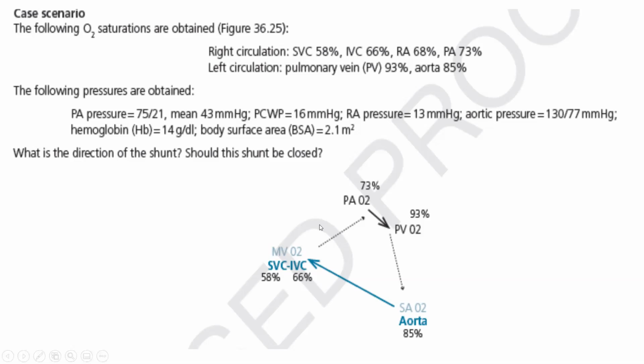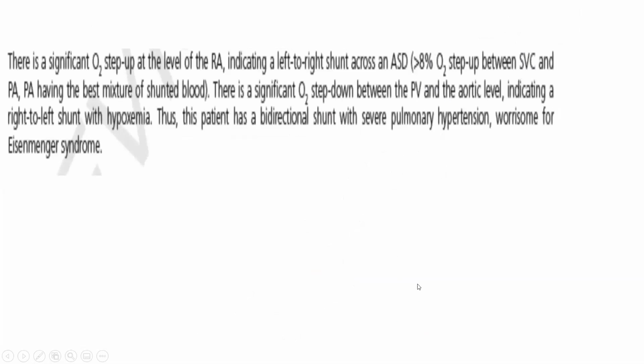Number two is, even if it is hemodynamically significant, is it already too advanced, at the stage of advanced pulmonary hypertension and right to left shunt, that I cannot close it anymore? I will hurt him by closing it. Those are the two questions to address. We know it's hemodynamically significant here, but we will, one, prove it, and two, see whether he has irreversible pulmonary hypertension with an irreversible right to left shunt that will preclude closure.